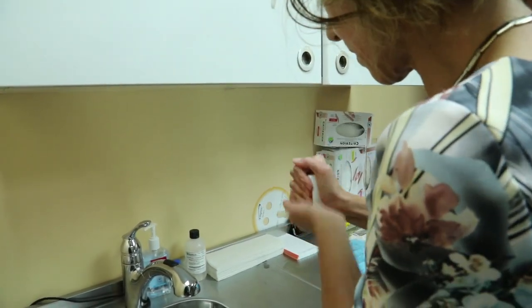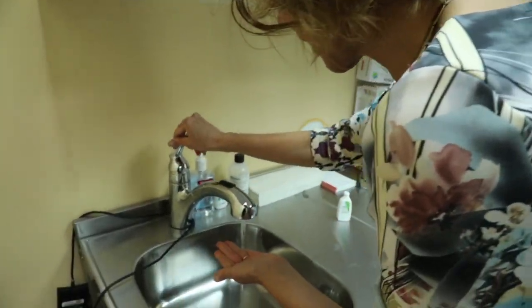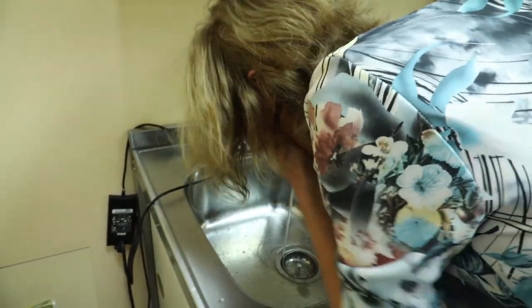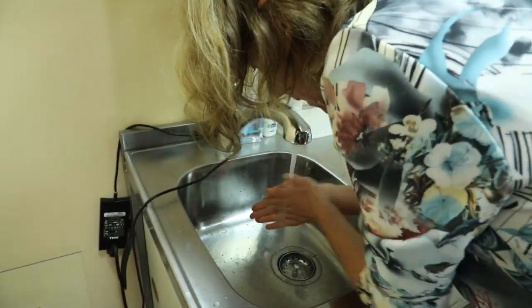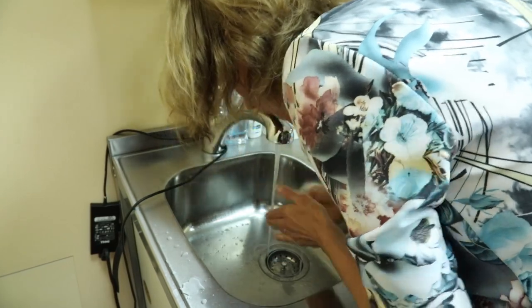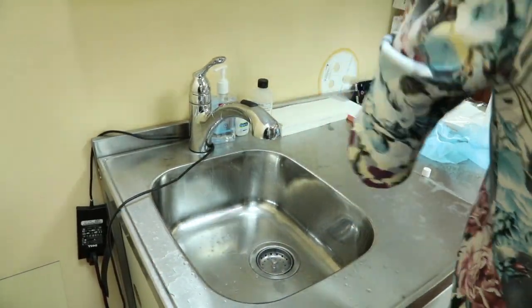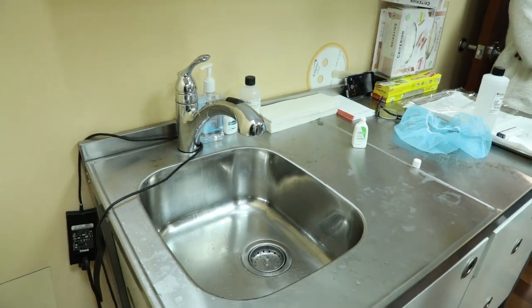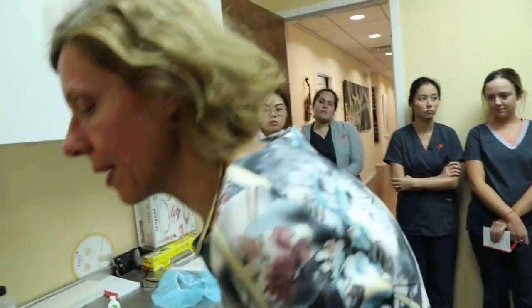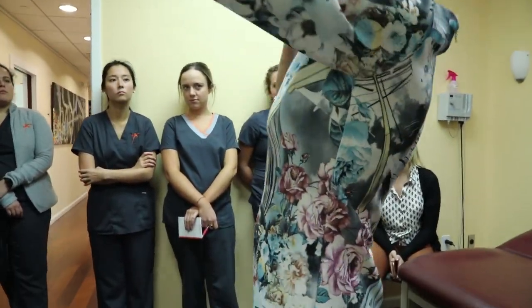It is the entire face that needs to be washed. And you can already at that moment supply the hair bonnet — that would be good practice — so that not everything gets totally wet, or you can do it afterwards. And then you take photographs.